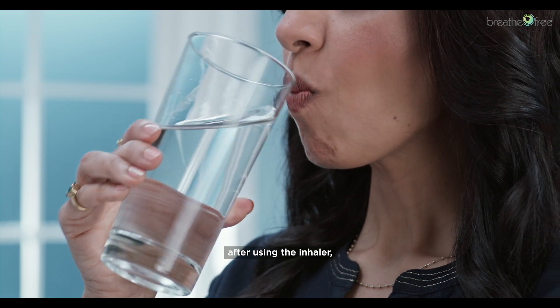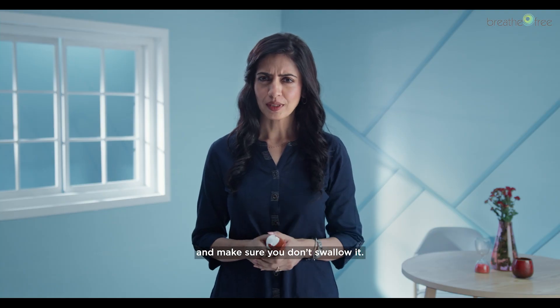Always remember: after using the inhaler, rinse your mouth with water and make sure you don't swallow it.